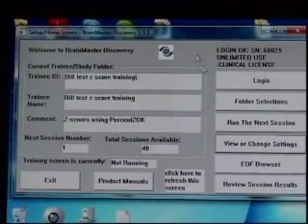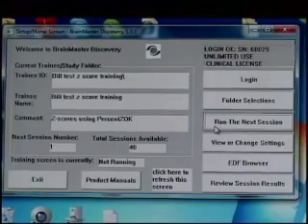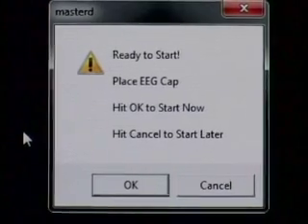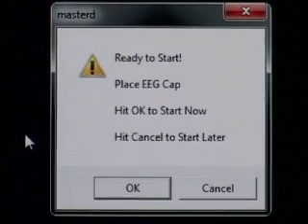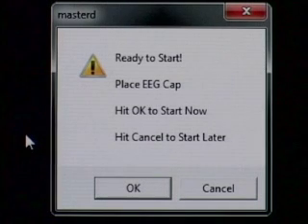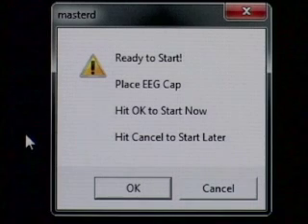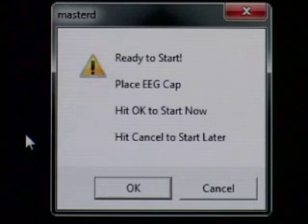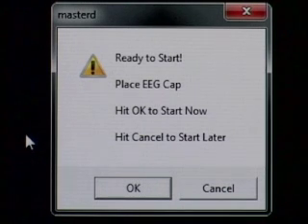We're back to our setup home screen. Our next step: run the next session. Our training screen appears — I'm going to go ahead and maximize this so it's easier to see. I then go up to the word 'begin.' The first window that appears says 'Ready to start — place EEG cap now.' With the Discovery, for training purposes, you could be using either a full cap and gelling just the electrodes needed, or you could be plugging in single electrodes at the top of the switch box.